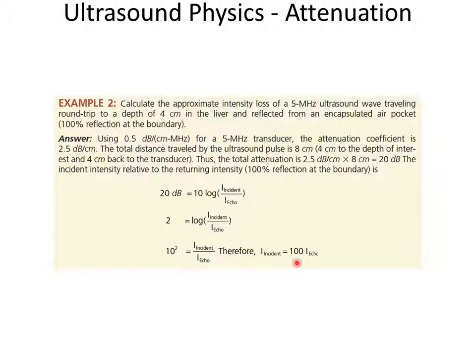So you're using your ultrasound transducer as your speaker and as your microphone, right? And there's orders of magnitude differences in the amplitude of vibration that thing has to achieve in order to do that. So technologically, it's an interesting problem, right? When you're in transmission mode, you're working at factors of 100 to 1,000 higher than when you switch to receiver mode and listen.